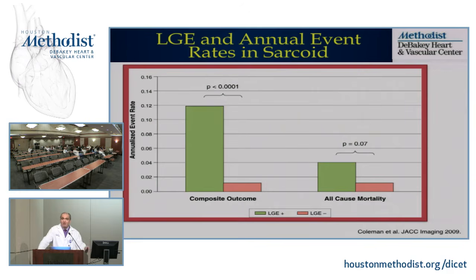Do you think we could use T2 imaging to follow up? Yes, you could. I mean, the challenge with the T2 imaging is, typically you want to do your T2 weighted imaging in an area where you see hyperenhancement, right? Problem is you have to do the T2 imaging before you do the hyperenhancement imaging. So unless you do basically every single short axis slice with T2 imaging, you're kind of stuck with, after you know where the area of abnormality is, you can't go back and do it again unless you bring the patient down another day, right? Now, your question is, if you know already this person, for example, who's got evidence of abnormality in a specific area on your LGE, when you want to see them for follow-up 2 months later, now you know the specific areas to probe into, so you could actually do that, yes.